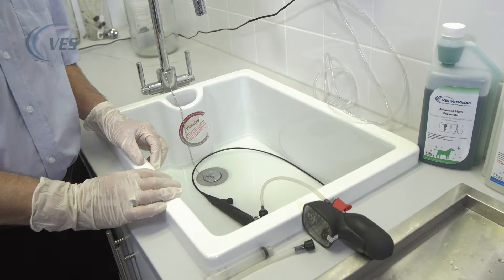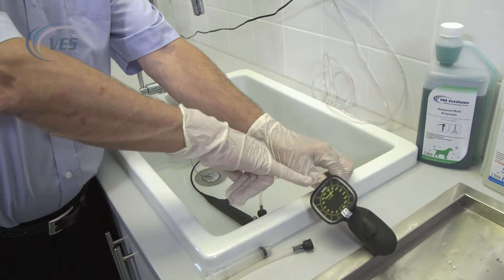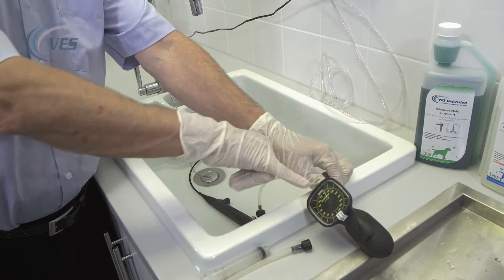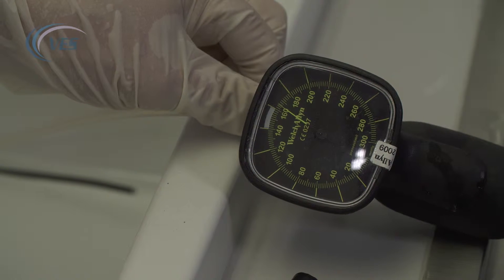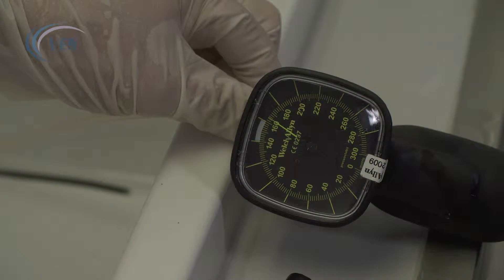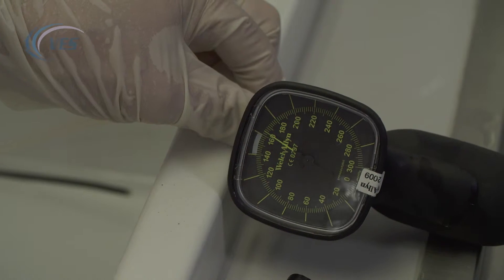With the scope immersed in the Enzymatic, we have to ensure that the leak tester remains dry, so that stays outside of the sink, and that the pointer remains constant at 160 millimetres of mercury. If that pointer starts to drop, take the scope out of the chemistry and phone our service department — it could be something that we need to talk to you about over the phone.